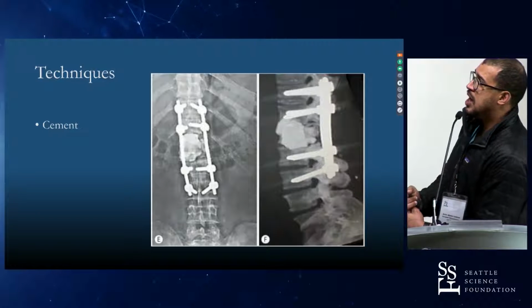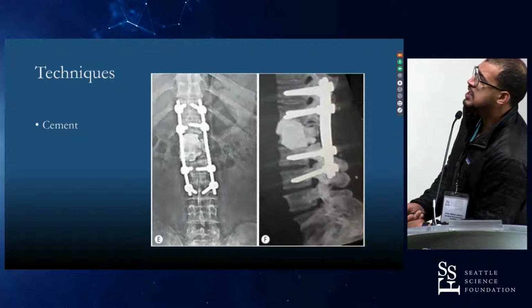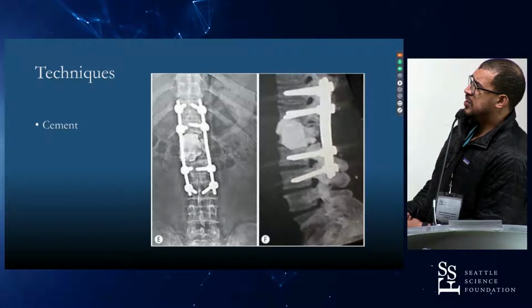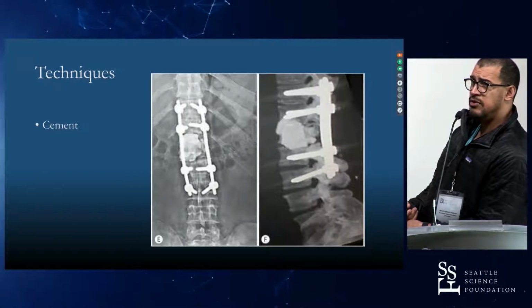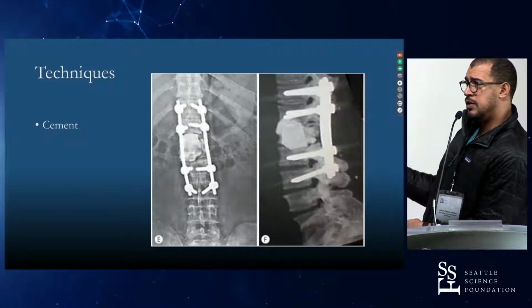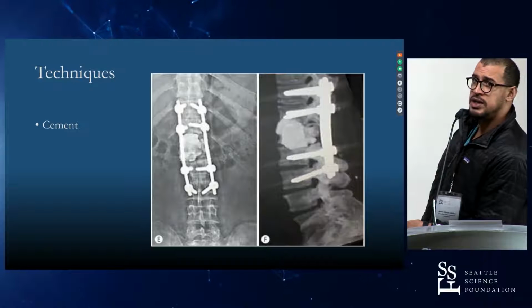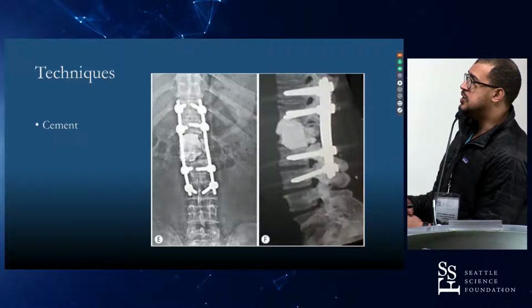In cases where you have a palliative treatment, where you're just decompressing maybe a tumor or a very sick person with an infection, these can be very effective to get them through that initial insult, but it's not going to restore the architecture like we'd like to do in the ideal situation.